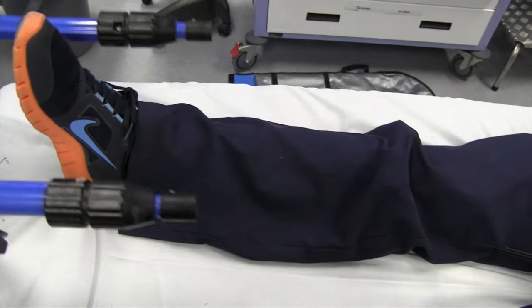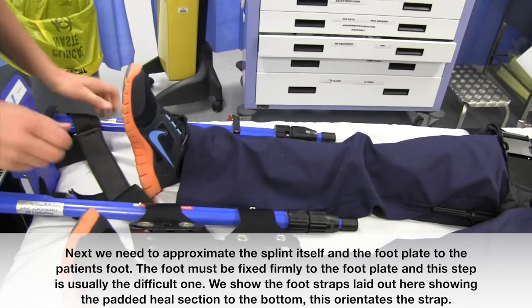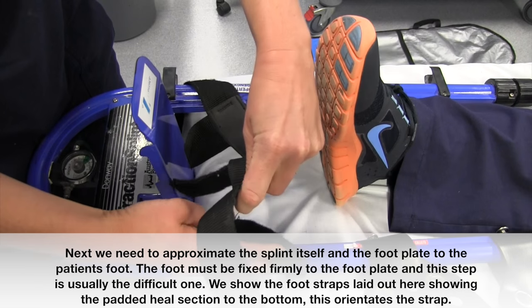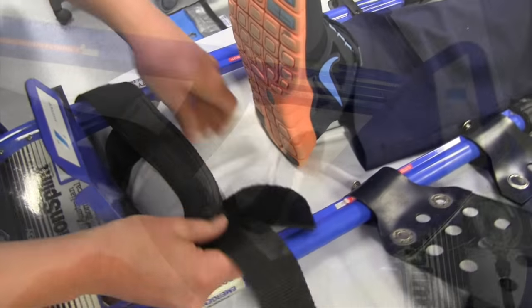Next, we need to approximate the splint itself and the footplate to the patient's foot. The foot must be fixed firmly to the footplate, and this step is usually the difficult one. We show the foot straps laid out here, showing the padded heel section to the bottom — this orientates the strap.